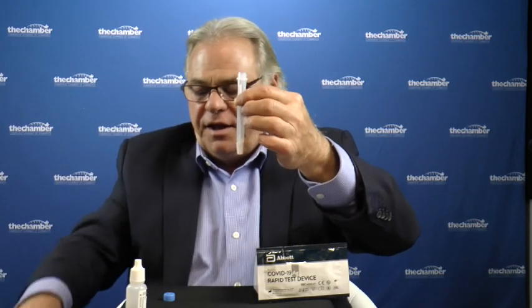At that point, you can take the tube. You need to spin it around 4 or 5 times in the tube, pressing the swab up against the edges of the tube, and then take it about halfway up, squeeze the tube with your 2 fingers, and just squeeze out the swab a little bit. You will also notice there's a break point on the plastic part of the swab. Just simply snap it off and let the swab fall back into the tube. You are now ready for screening. You put the lid back on, and your employee can actually open this and prepare their screening pad beforehand.